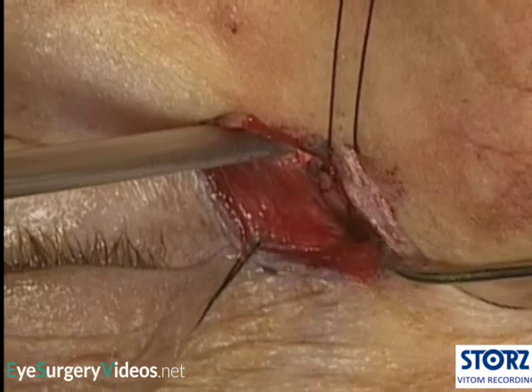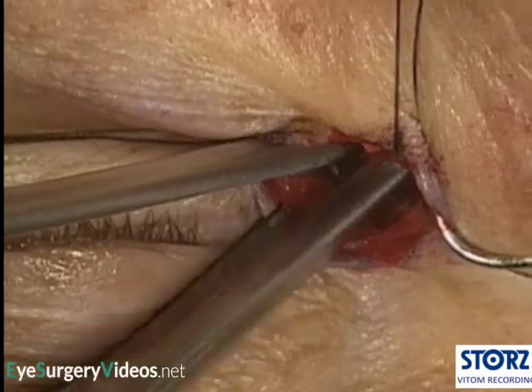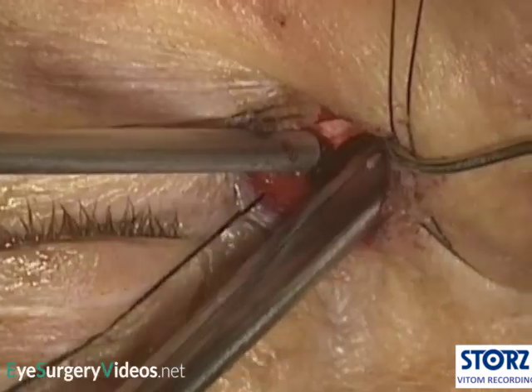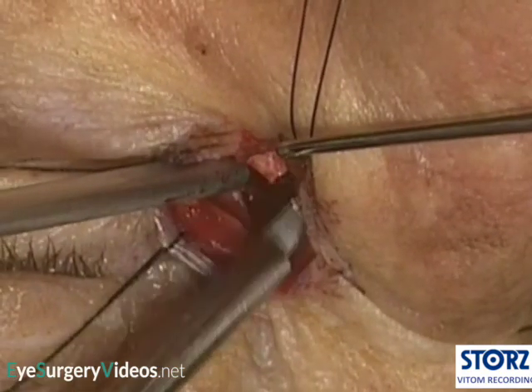The small rongeur is carefully passed into the small lacrimal bone defect. The rongeur is again rotated to ensure that nasal mucosa is pushed well away and will not be caught in the punch. Several bony punches are made until the ostium is large enough to accommodate the larger rongeur. The punch must always be used to punch out sections of bone and not twisted to break off fragments, as this risks a spiral fracture extending superiorly towards the skull base.